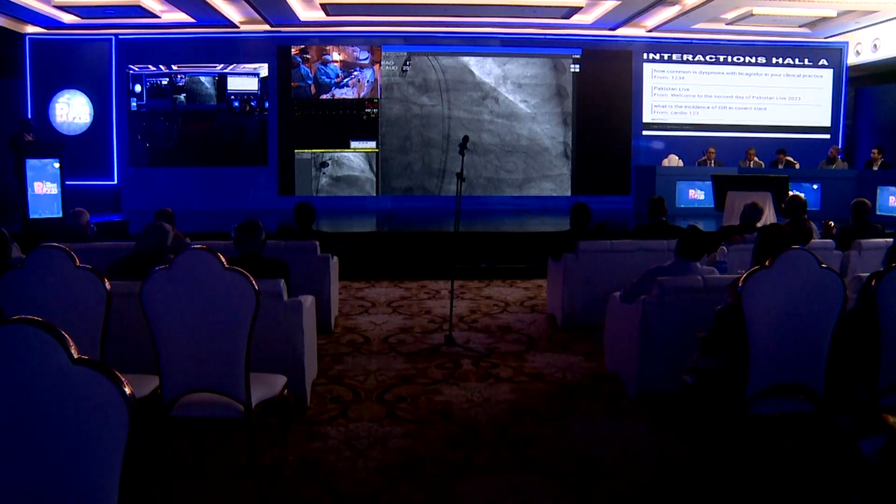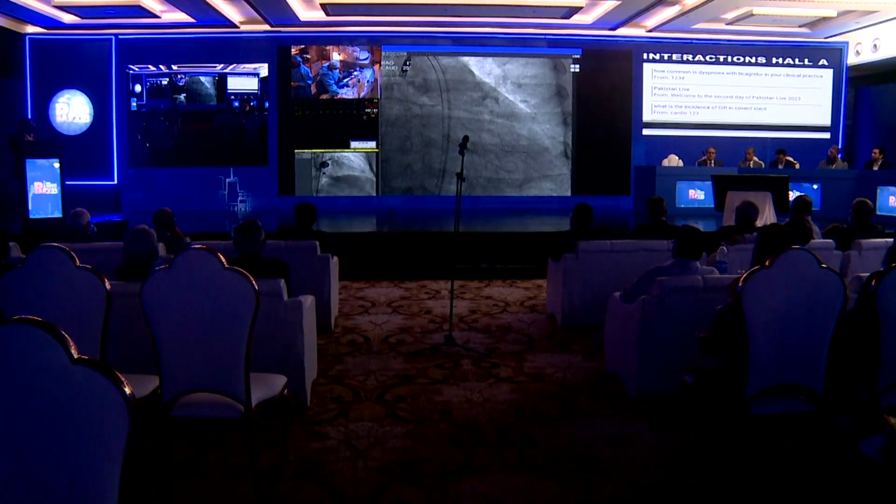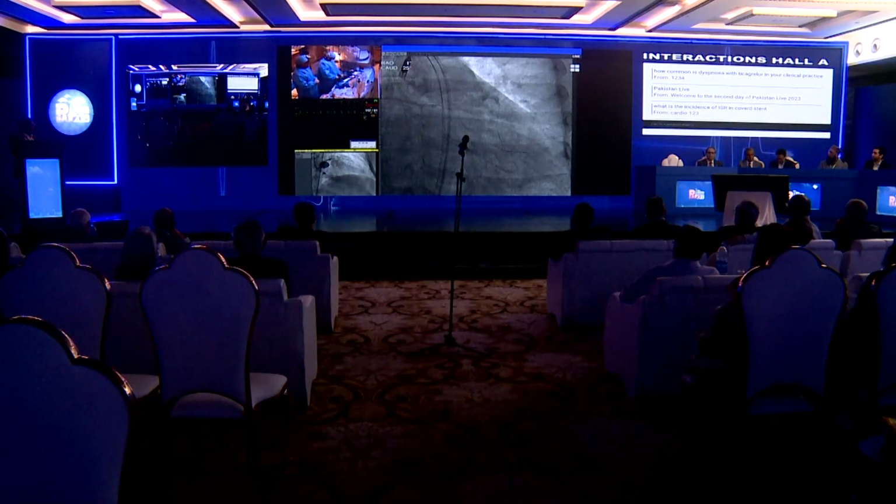So as far as we saw, it's a 74-year-old lady with chronic kidney disease and obviously ischemic cardiomyopathy, low ejection fraction, and then we can see this ostial left main followed by ostial LAD maybe, and an Impella being there and now wiring this. It's a femoral approach, so that's all we can see right now.